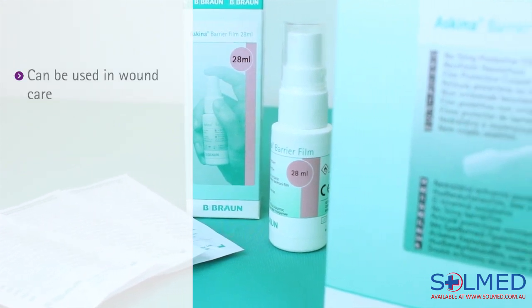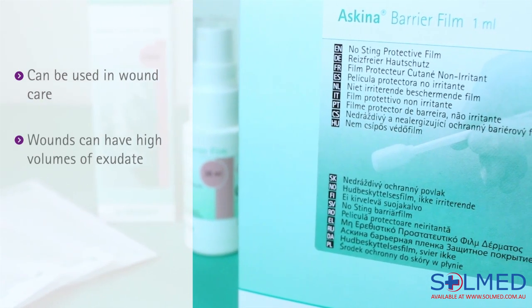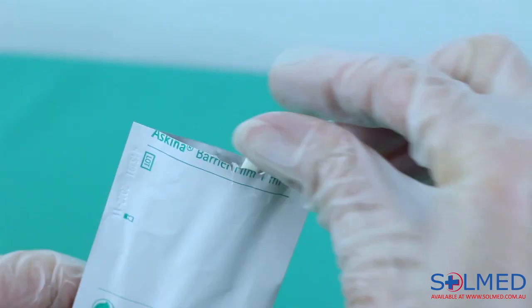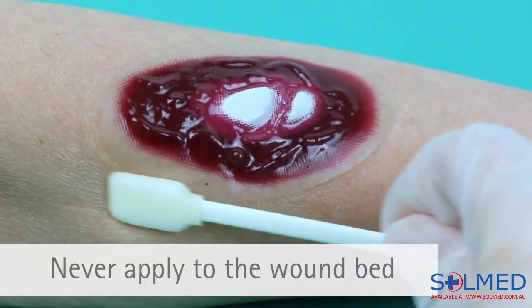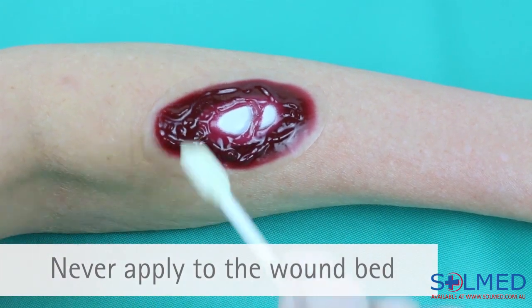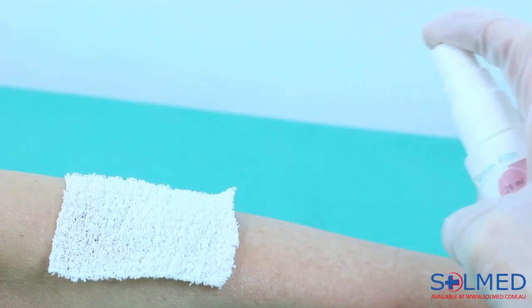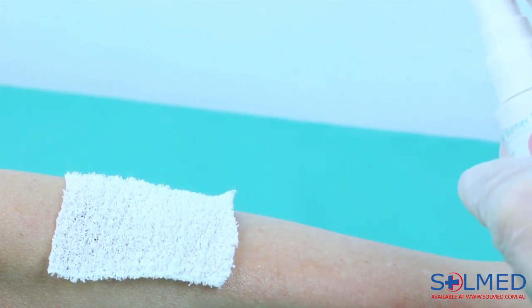Skeener Barrier Film can also be used in wound care. Wounds can often have high volumes of exudate, and Skeener Barrier Film can protect the peri-wound skin from hyperhydration and/or maceration. After cleaning the wound bed and surrounding skin, apply Skeener Barrier Film to the peri-wound skin area. Even though it can be applied to compromised skin, it should never be applied to the wound bed. If using the spray application, place some form of sterile protection over the wound bed before applying the barrier spray. Please consult with your wound care team and the instructions for use regarding frequency of application.